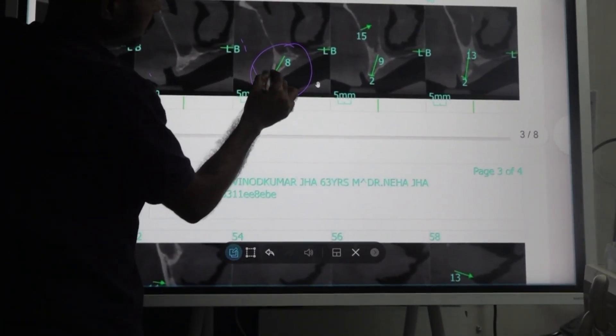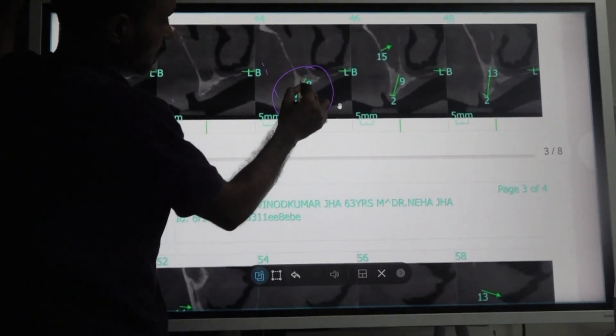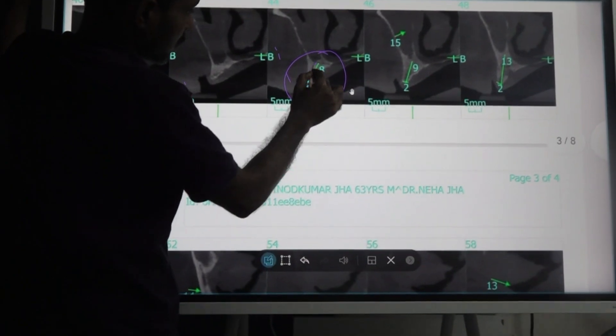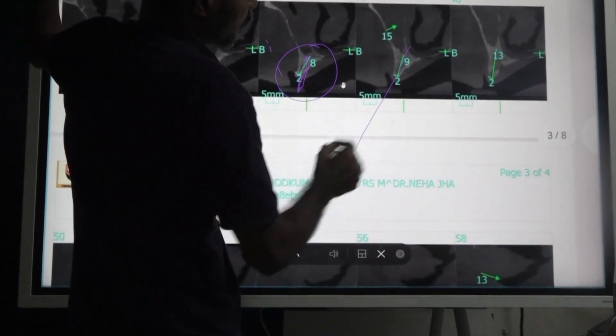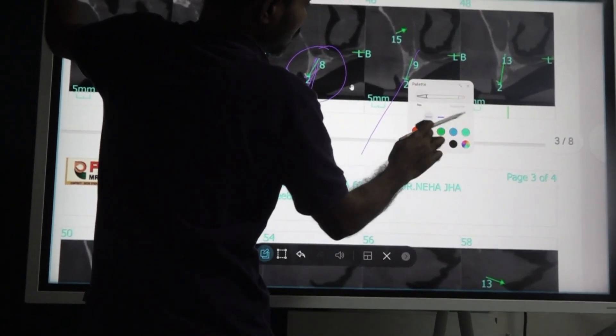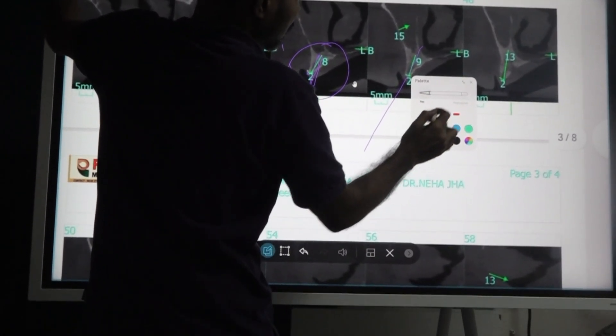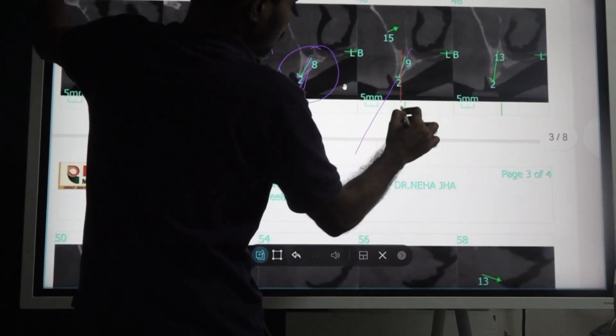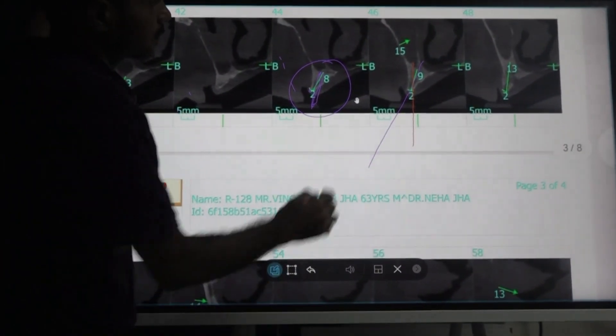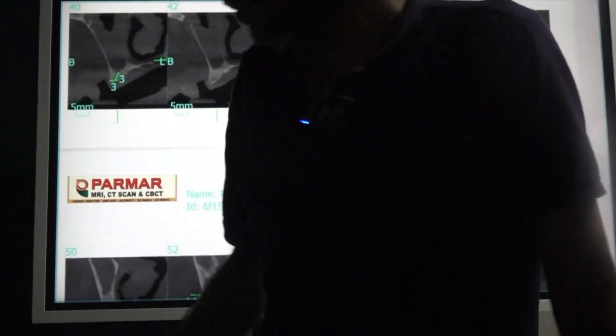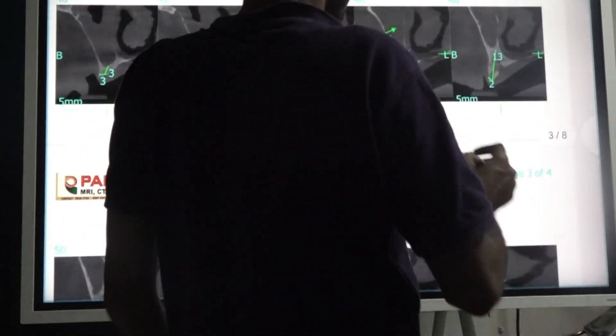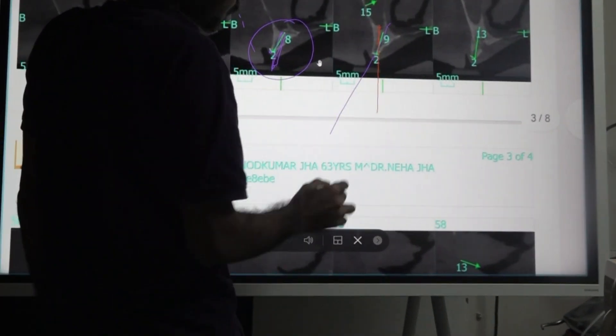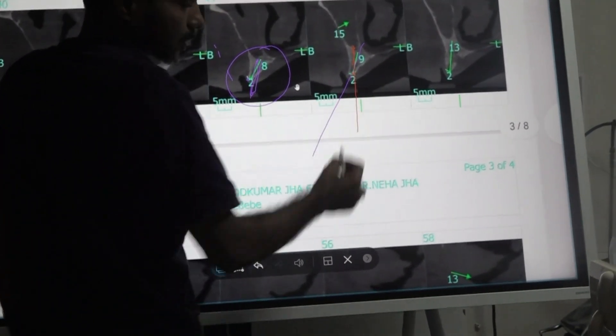So the ridge is very thin. But the bone quality is good. What you can do is you can do a palatal approach technique. So instead of going through the crest like this, you can start the drilling palatally. Even a compressive implant you can place. 3.75. Not wider diameter. 3.75 you can place. The length should be selected where you feel the drop. Here some of the rough surface may be exposed palatally but that is okay. Because palatally there is a soft tissue.